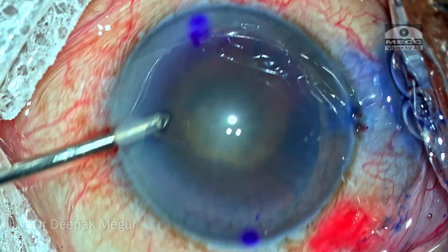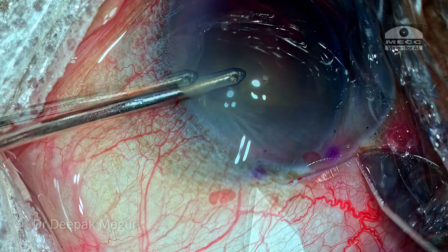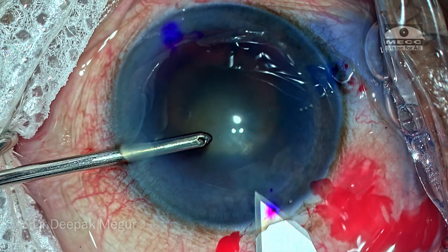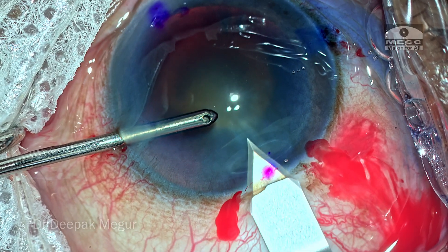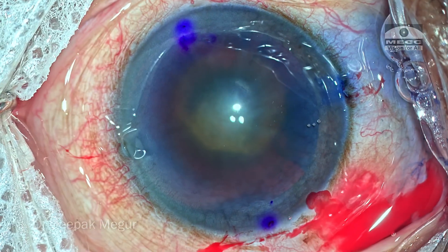While making the incision, I prefer to turn the globe away from me just a bit so that I get enough corneal tunnel as I make the perforation into Descemet's membrane and into the anterior chamber. This gives me an adequate amount of tunnel effect.